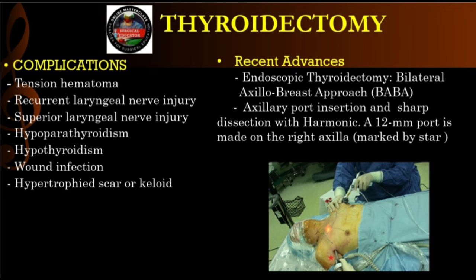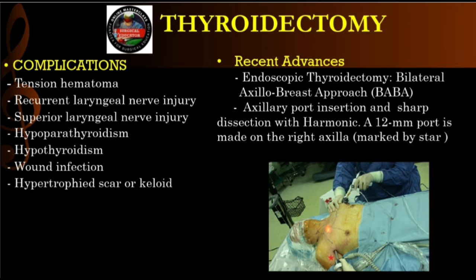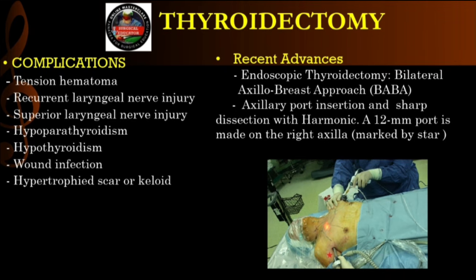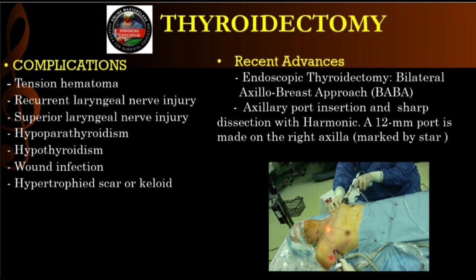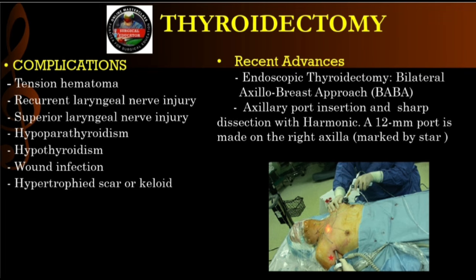You use long, rigid instruments to tunnel forcefully under the skin of the chest all the way up past the collarbones to reach the thyroid from below. Like building a ship in a bottle, but working through a long tunnel. And the slide notes you heavily rely on the harmonic scalpel here. Because trying to tie a tiny silk knot around a fragile vein using foot-long sticks through an armpit is nearly impossible. The ultrasonic sealing of the harmonic makes this remote surgery viable.